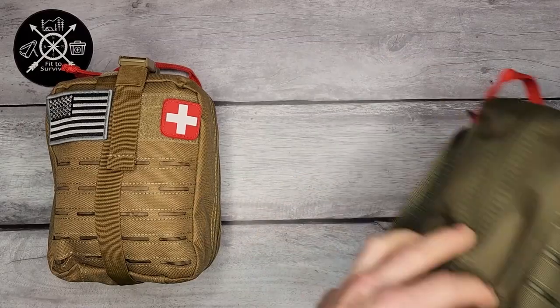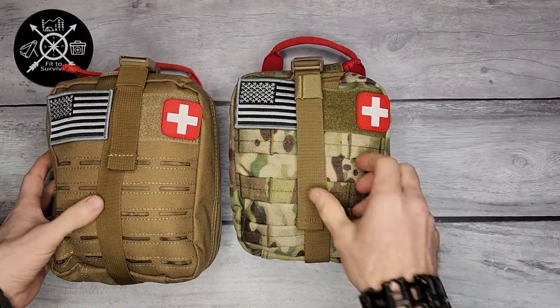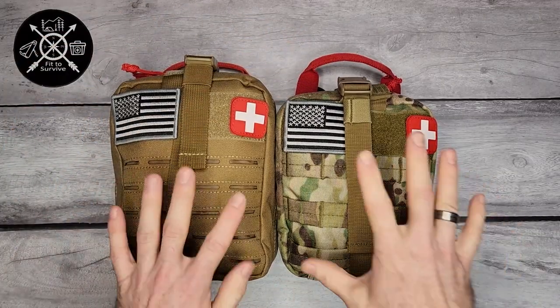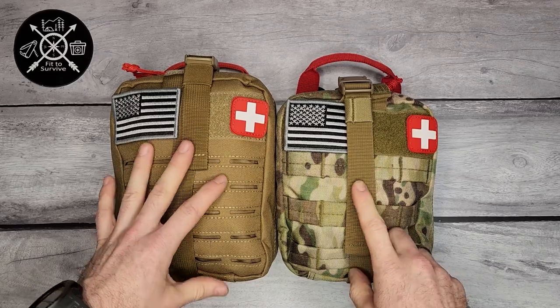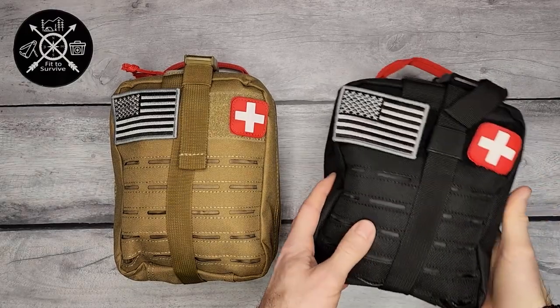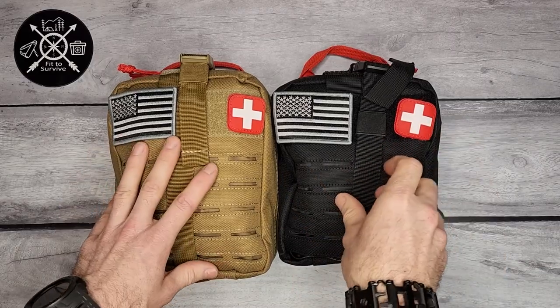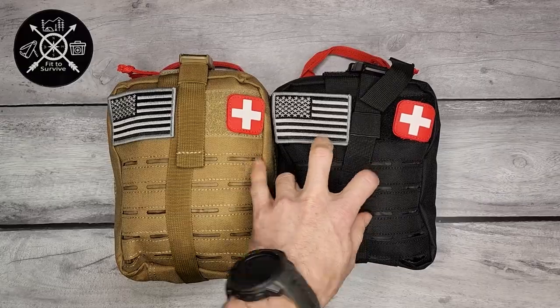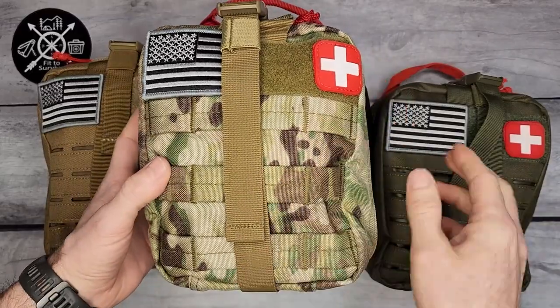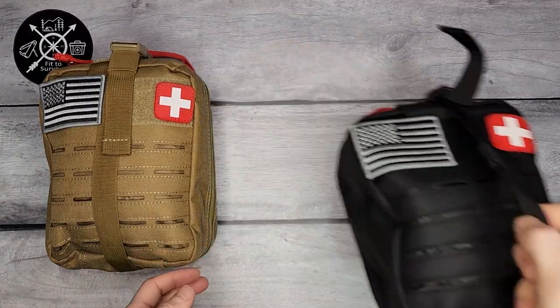There are four colors total: tan, OD green, camouflage, and tactical black. I noticed the camo bag is slightly smaller, but the contents of all these bags are exactly the same — it's the same advanced trauma kit, just different color variations. It simply lets you choose whichever works best for you.